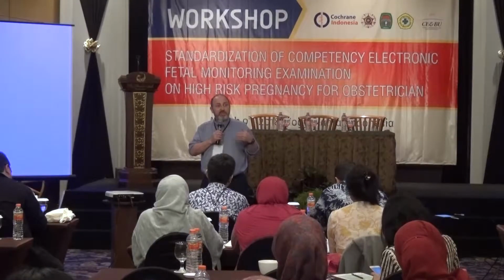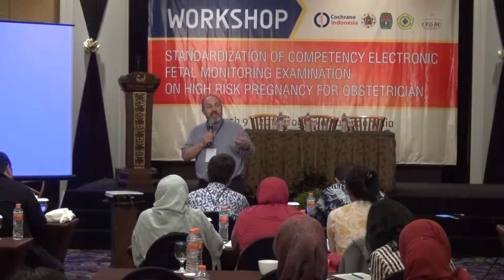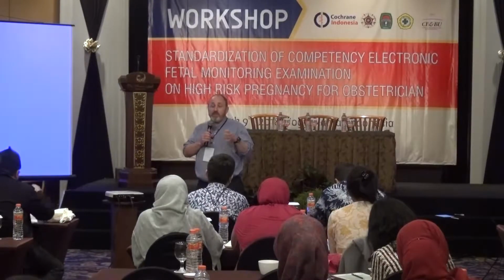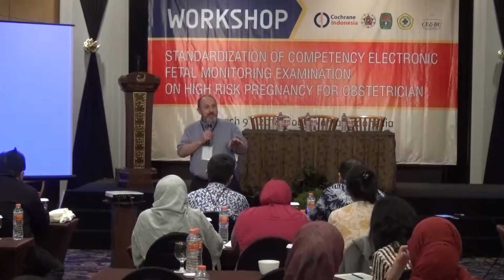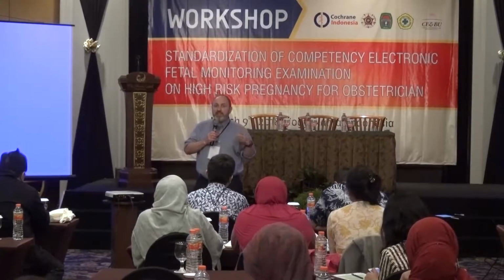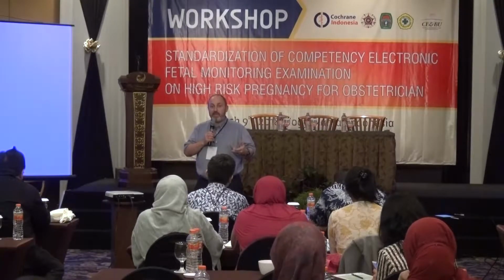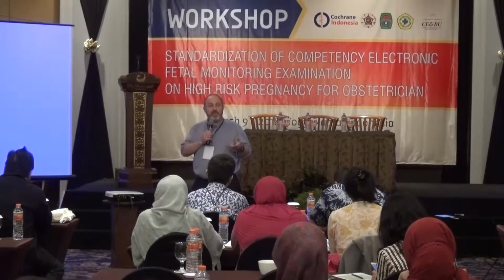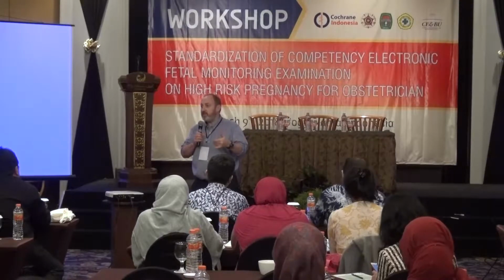So early decelerations are associated with fetal head compression, but we need to avoid making the mistake of assuming that all early decelerations are due to head compression. For example, if you have a multiparous woman and you do an abdominal examination and you find the head is free, not engaged, and you've got early decelerations on your tracing, it should be a cause to keep a very close eye, because it's likely that the tracing may deteriorate further, because there isn't head compression which should be stimulating those decelerations.